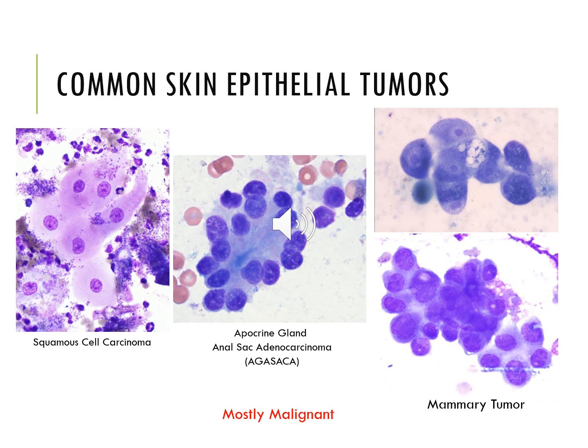These behave very aggressively, though, so it's unfortunate that they look so benign but behave so aggressive. So that's just something to keep in mind.